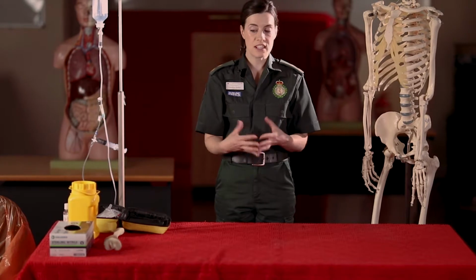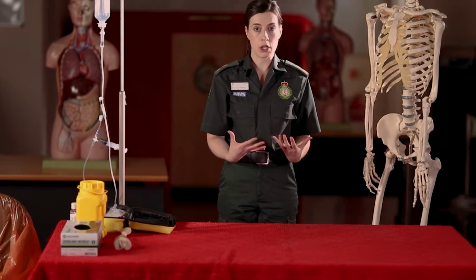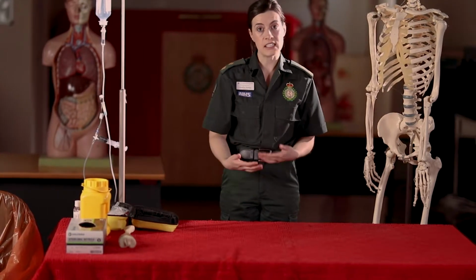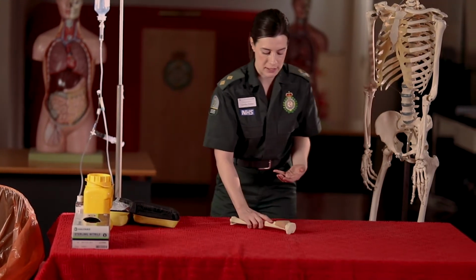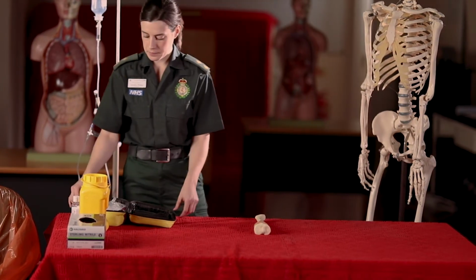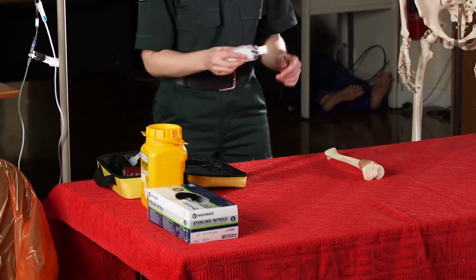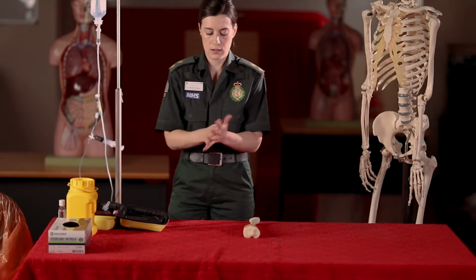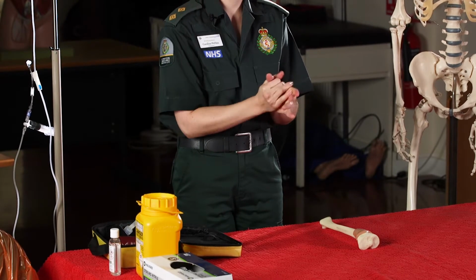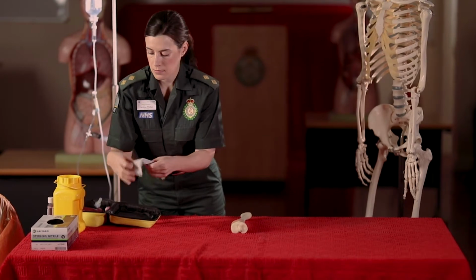So once I've primed my equipment and located the site on the patient that I'm going to go for, I can then go ahead and perform the procedure. So I've already found my site. I'm going to clean my hands and don my gloves.